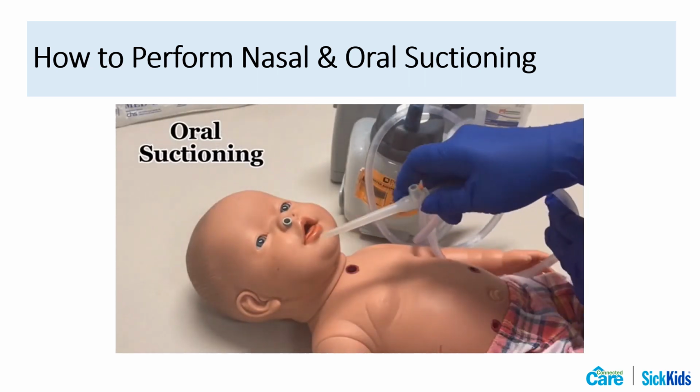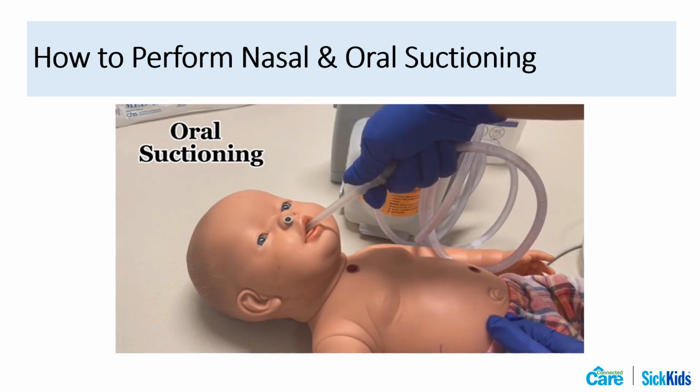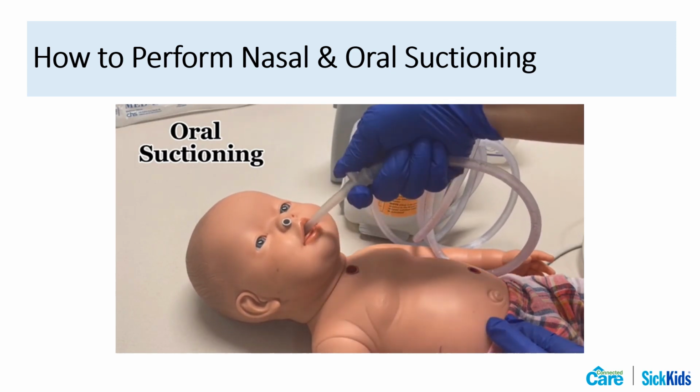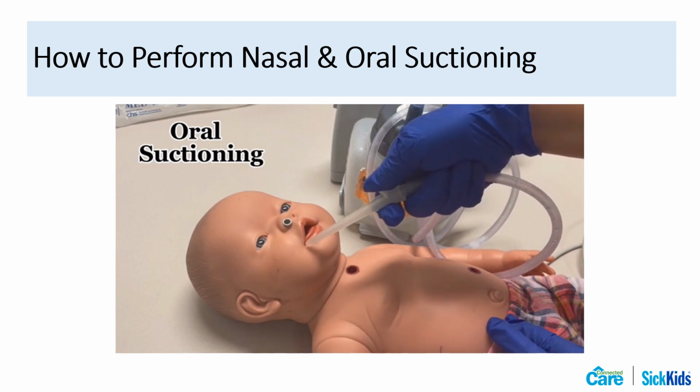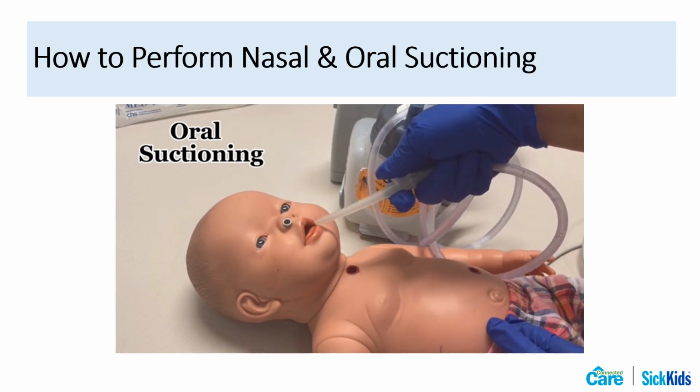Insert the suction catheter or tip into the child's mouth. Keep your thumb off the suction control port. Apply suction by holding your thumb over the control port to remove mucus. Limit suctioning to 5 to 10 seconds.